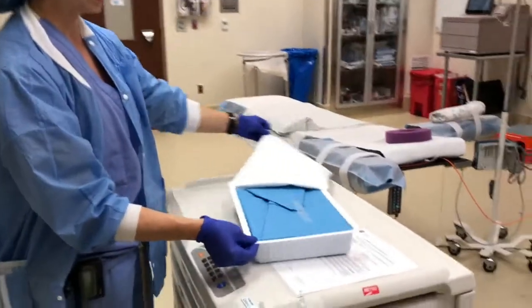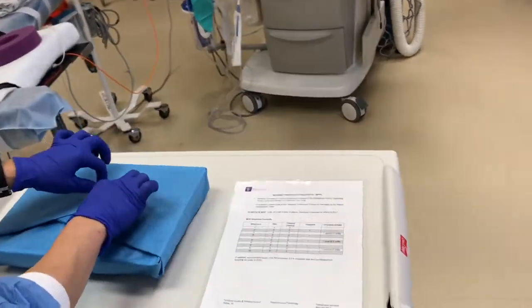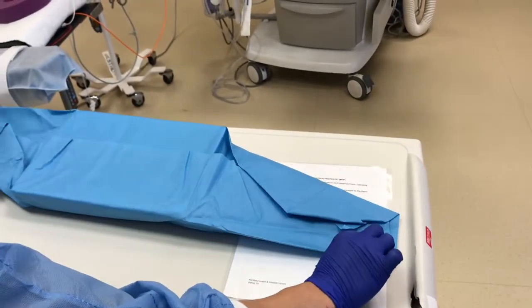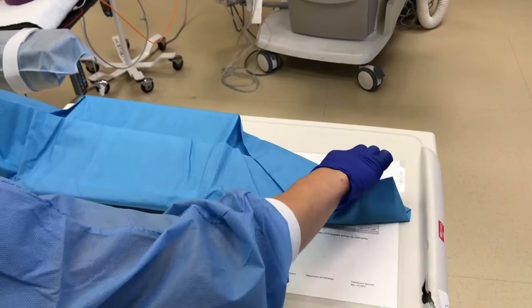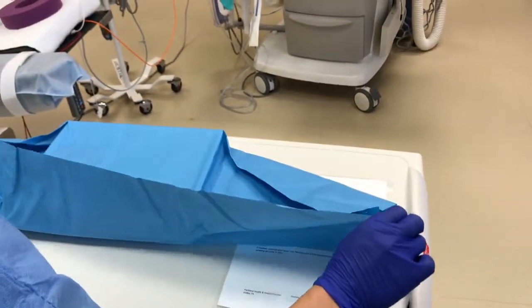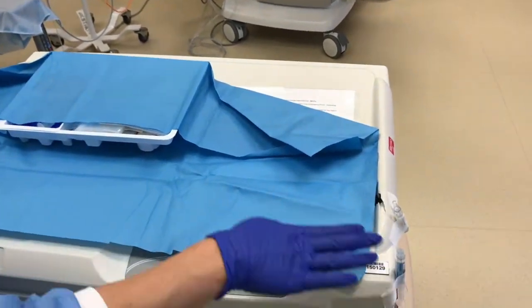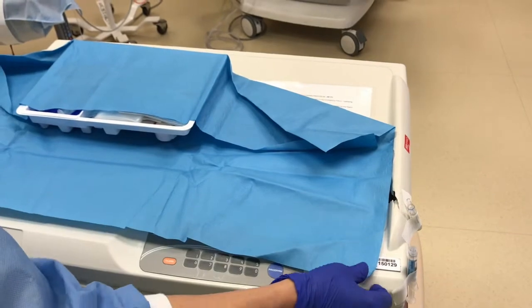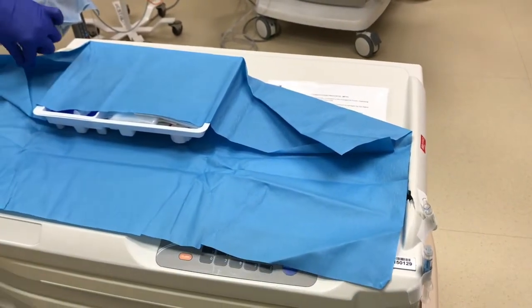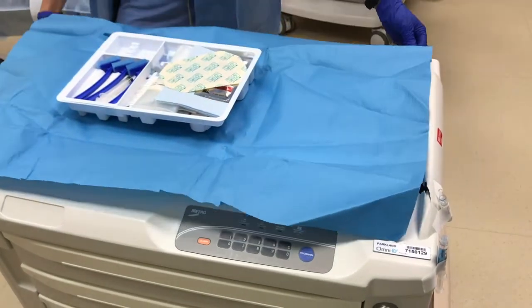You want to open this kit sterilely. So as much as you can, try to only touch the very outer edges. You can see there are these little tabs that you can pull on. You want to open it very carefully, just getting the edges. And do be aware of your medication. You don't want to accidentally flip your drape on top of the medicines that you've taped over here. So be aware of that. And then just carefully grab the edges here and open.